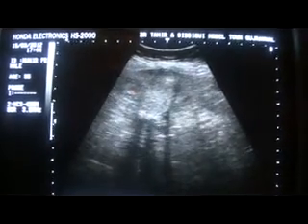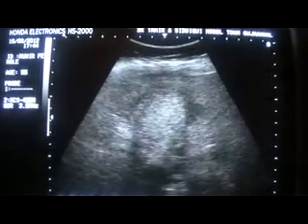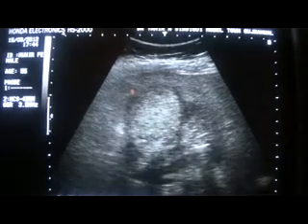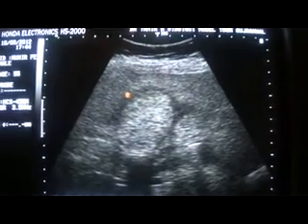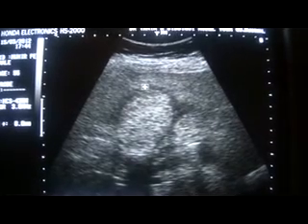Now a gallbladder that measures more than 5 centimeters is full of high strength internal echoes, and the wall is not seen. Rather, in place of the wall, we see a hypoechoic rim around it merging into the adjacent liver. This is the portal vein.